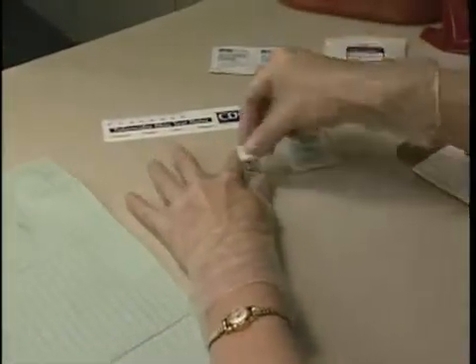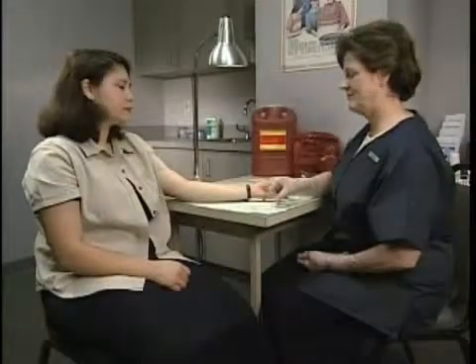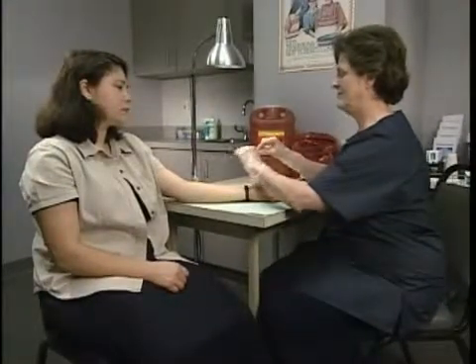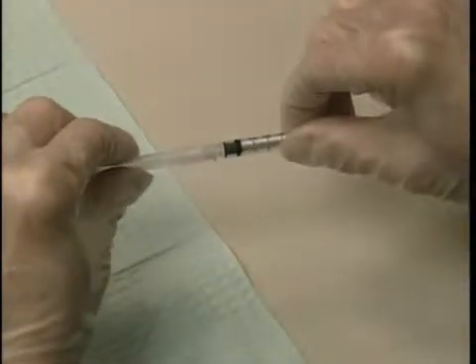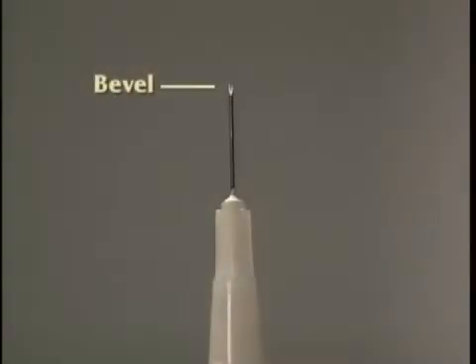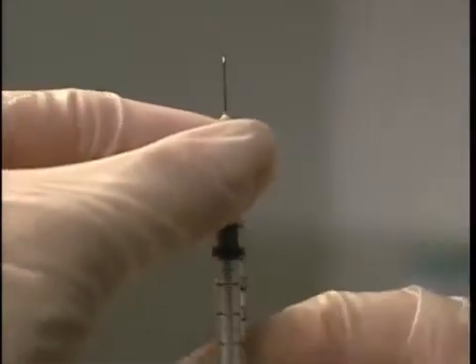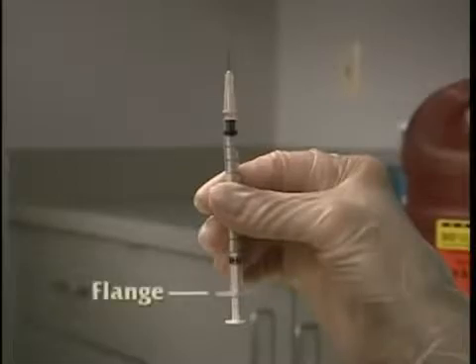Wipe the top of the vial with a new alcohol swab before drawing up the tuberculin solution. Pick up the syringe and be sure to fasten the needle tightly on the syringe by holding the cap and twisting it onto the tip of the syringe. Next, remove the needle cap. The needle bevel should be perpendicular to the flange of the syringe. If necessary, turn and tighten the needle to line up the bevel correctly with the flange.